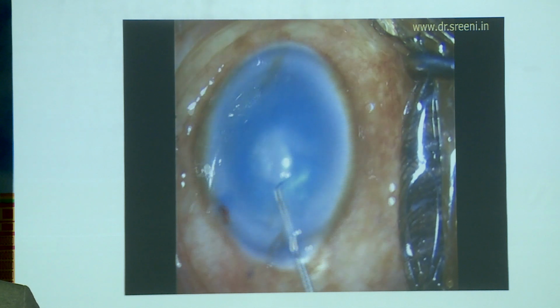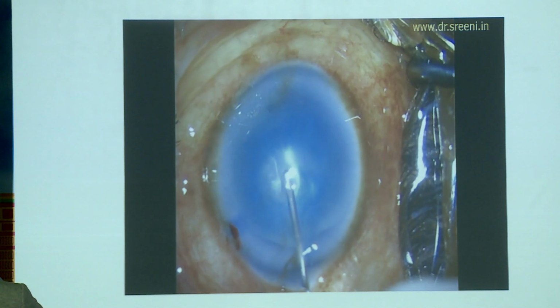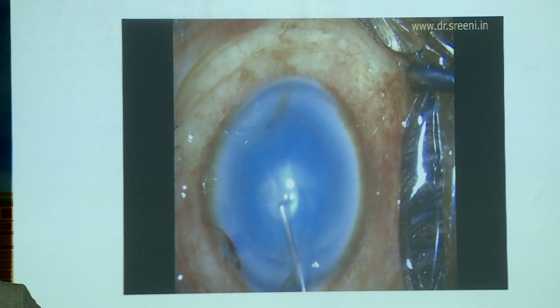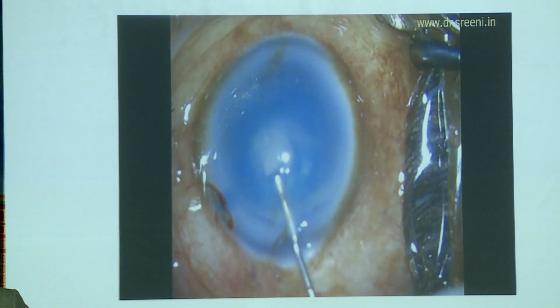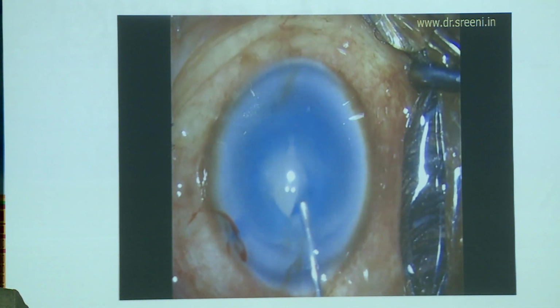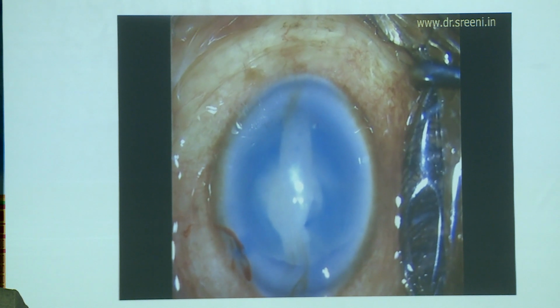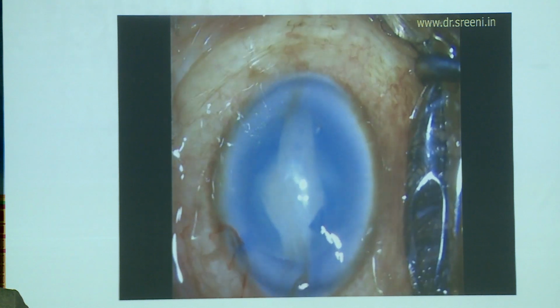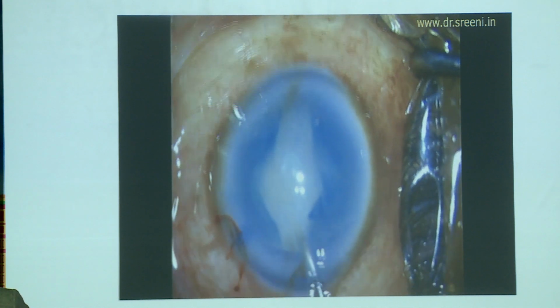So the basic idea is to have a small rhexis in the beginning. Make sure that it stays at the center. All the movements should be towards the center to make sure that it doesn't run off to the periphery. So that is what is being done here. You can see the pull going on to the center. So if this happens, this is a well open area now.